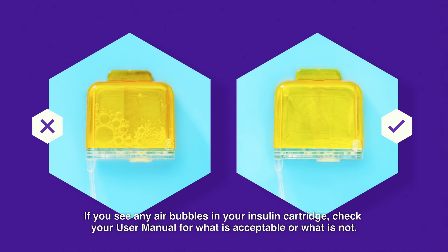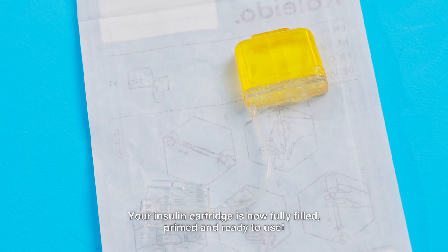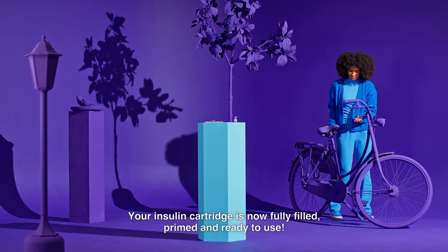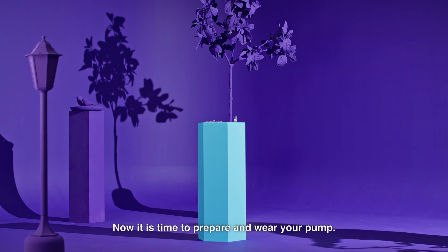If you see any air bubbles in your insulin cartridge, check your user manual for what is acceptable or what is not. Your insulin cartridge is now fully filled, primed and ready to use. Now it is time to prepare and wear your pump.